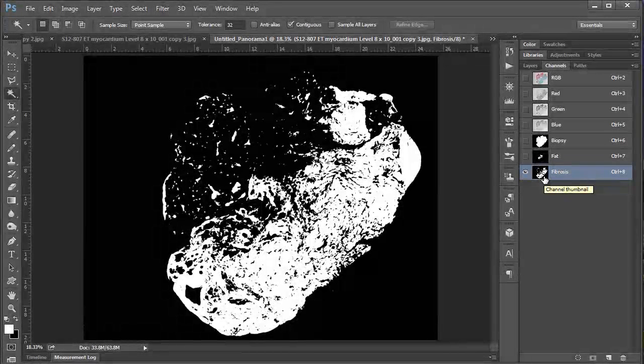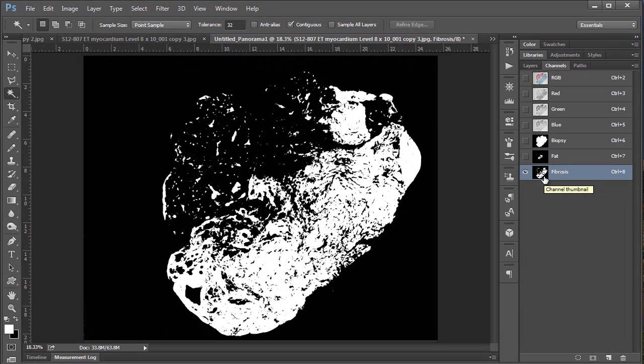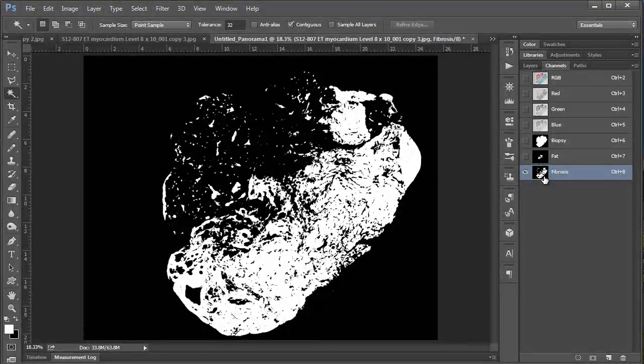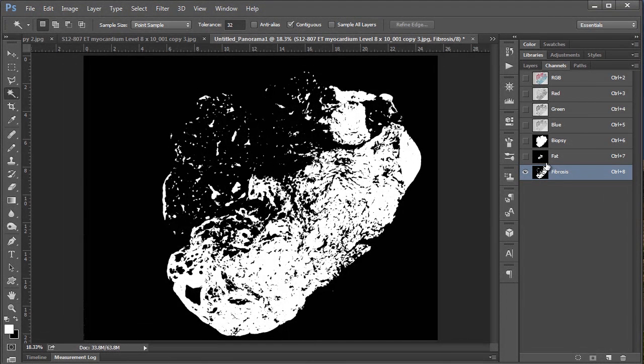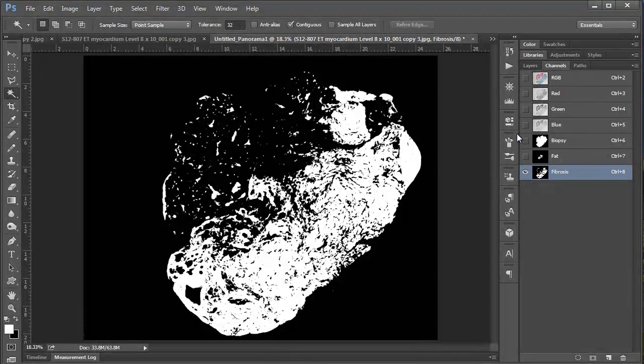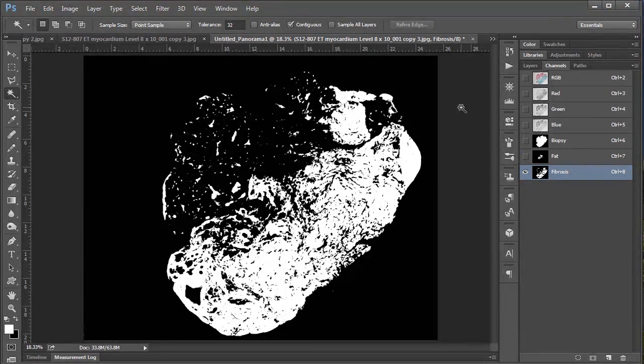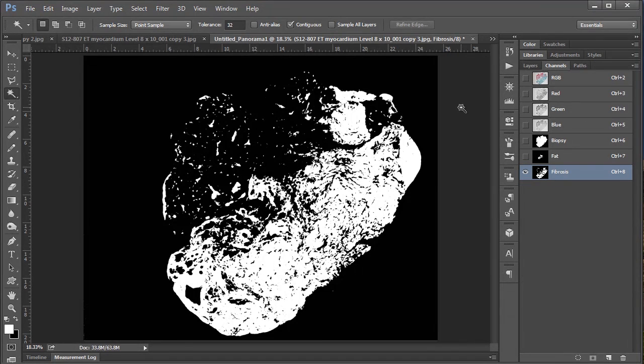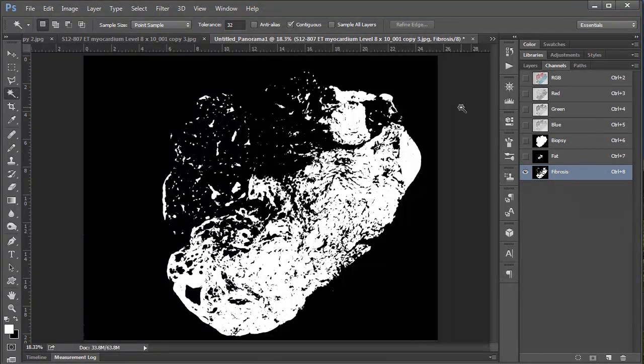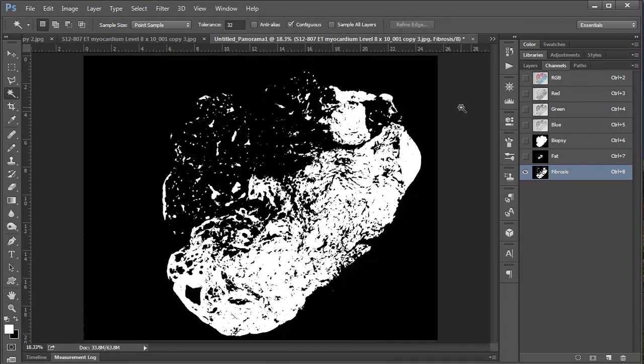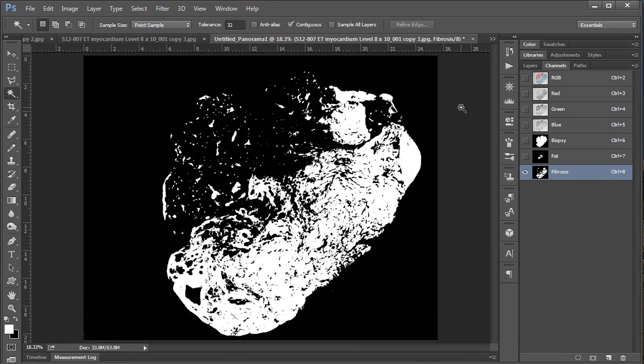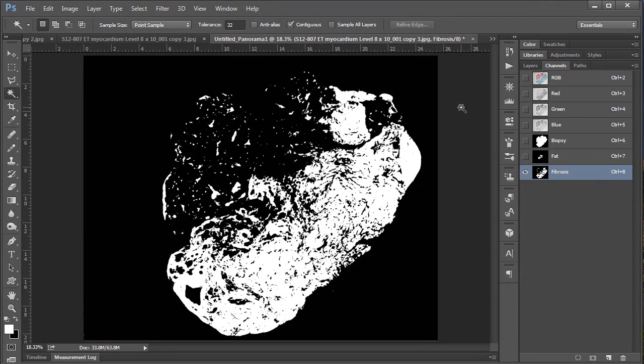And so I should note here that what we're going to be doing next is measuring the areas, and when I say that it's basically Photoshop is going to count up the number of pixels. Now these measurement tools come baked into Photoshop, I think CS6 and later on. So if you're using an earlier version of Photoshop such as CS3, you're going to need a different plugin to measure these areas. And the methodology might be slightly different. But for the time being I'm going to show you how to do it in Photoshop CC.